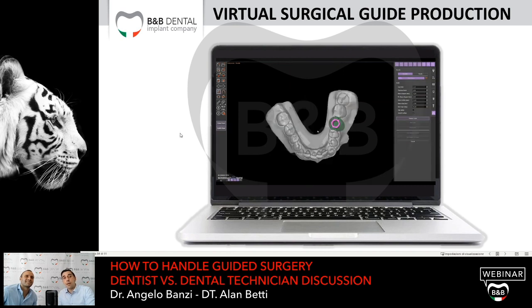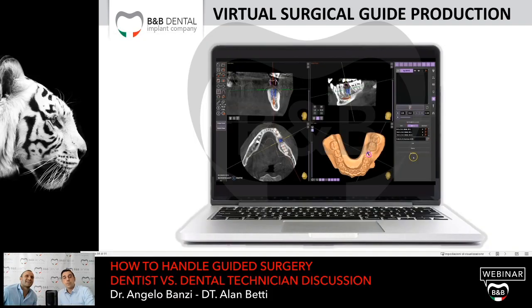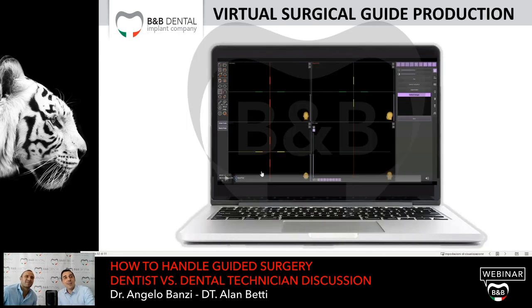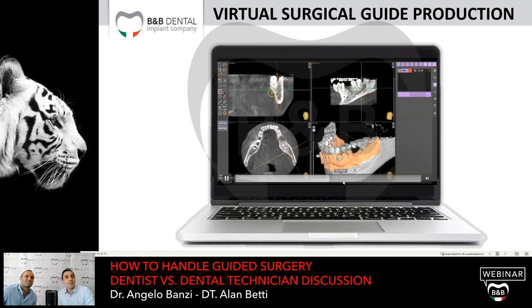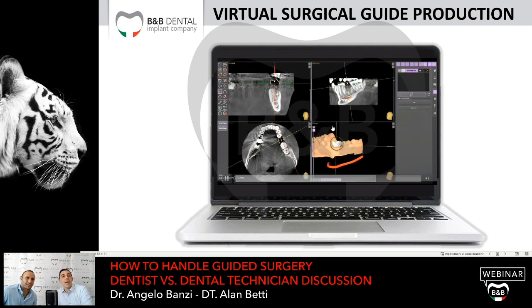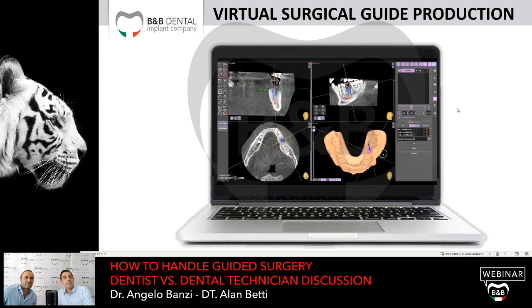But this is the surgical template. Yes, because I jumped the part of the surgical guide production. This is the virtual workup. And after the workup comes the positioning of the implant. Yes, thanks to the workup, I did the implant positioning.